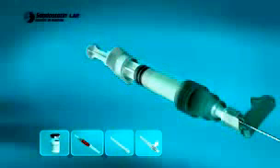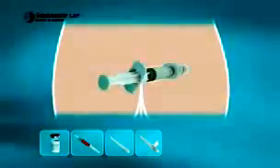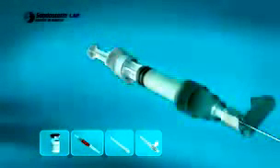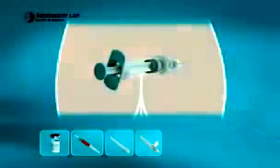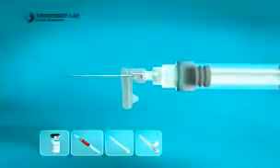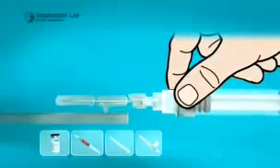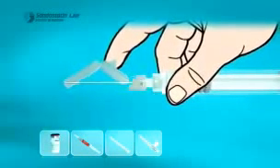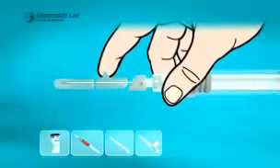Insert the needle into the right or left gluteus and draw back to ensure that no blood vessel has been penetrated. Inject slowly intramuscularly by deep intragluteal injection with steady pressure. Sandostatin LAR must be given only by deep intragluteal injection, never intravenously. Once the injection is complete, using a single-handed operation, activate the safety system of the needle, either with help of a rigid surface such as a table, or with a forefinger, making sure to always keep all fingers behind the needle tip. An audible click confirms the proper activation of the safety mechanism.